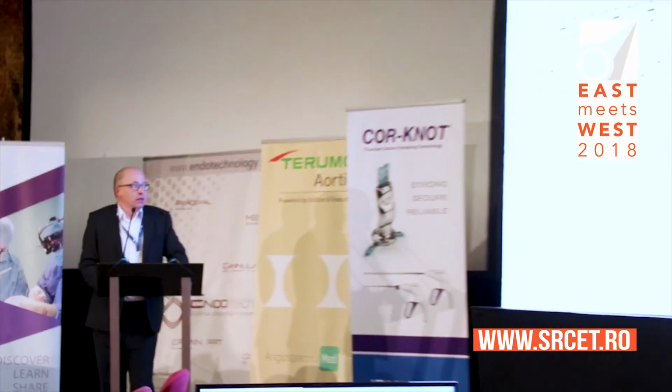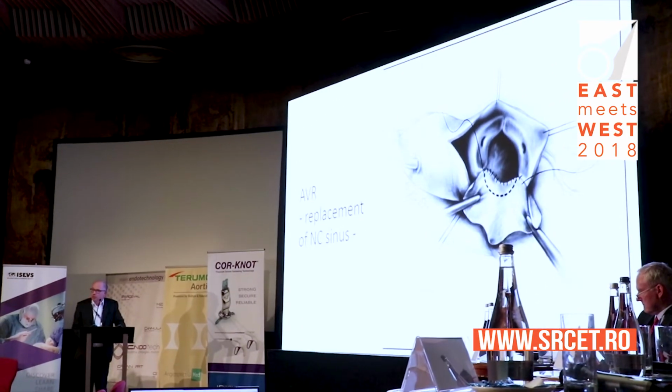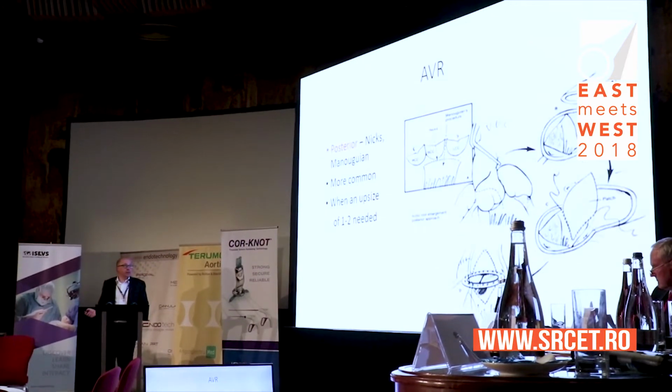The tilting valve technique is when you take the sutures in the non-coronary sinus, but the valve obviously stays below the ostia, and make sure that it opens and closes properly. Another way, if the sinus is small, you have to replace it with a pericardial patch that gives you more room. The principle is really the same.